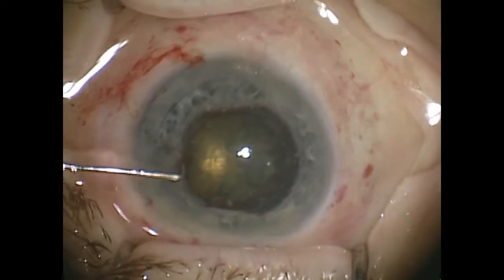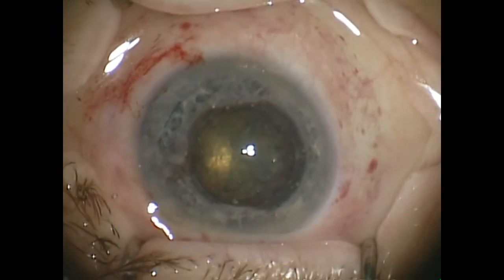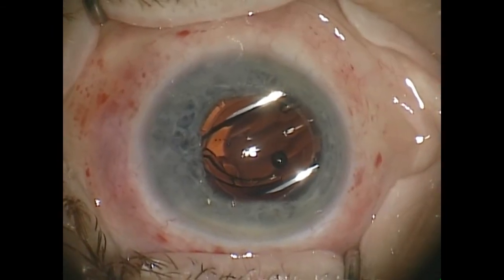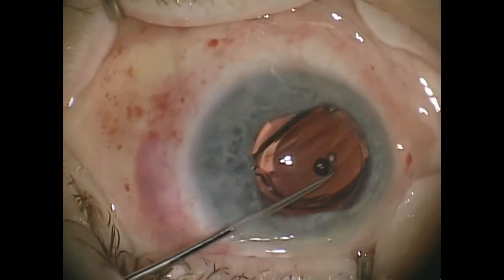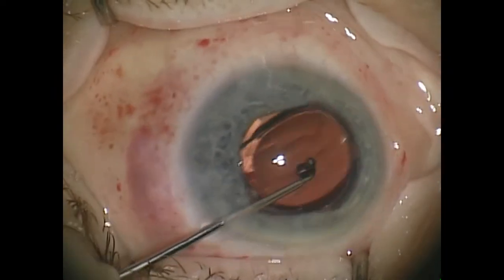You tuck it under the wings and now you get a nice six to seven millimeter pupil. After phacoemulsification and lens insertion we're going to remove the Clark iris dilator.